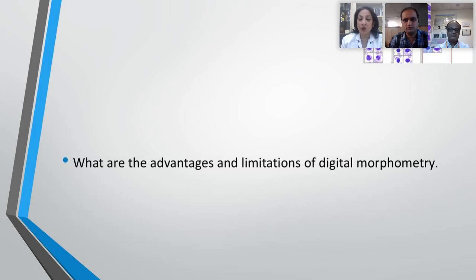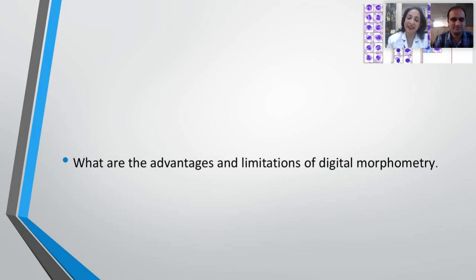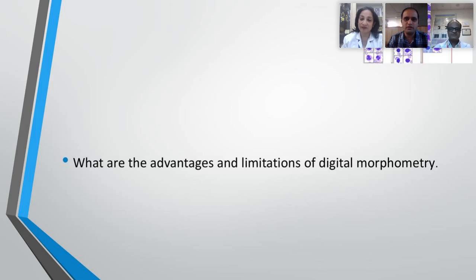And this is the way, Ankur, where we bring standardization and quality check in the pre-analytic also. Otherwise, we never were careful about what quality of slides we were getting. We were just rushing by doing microscopy. Now we actually know that the quality needs to be good. And in a way, it's helping end to end, pre-analytic to analytic. Exactly, ma'am. With the quality check, if I can report it on a microscope, I can report it on a digital morphometry.